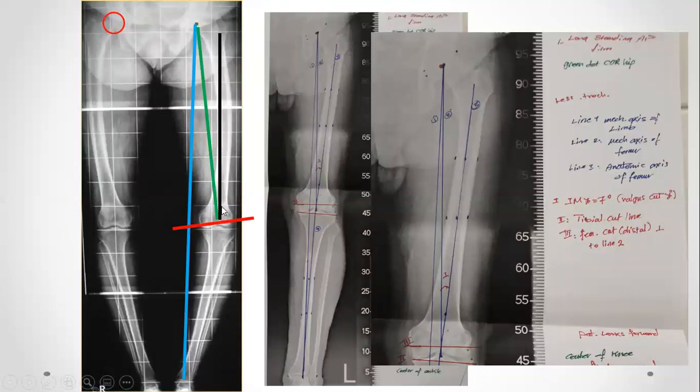In order to have a rectangular, well situated loads, because the loads of the body will be even if you have cut the distal femur perpendicular on the mechanical axis, in order to distribute the load well. Okay. Regarding the tibia, we will see how the mechanical and anatomical axes are parallel.